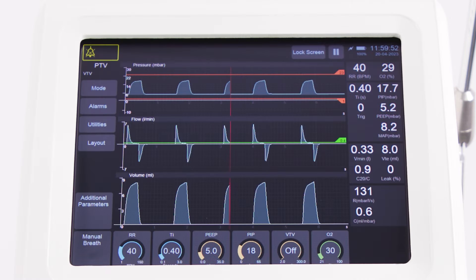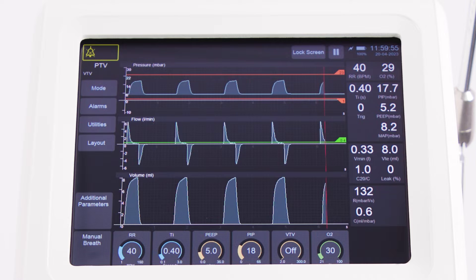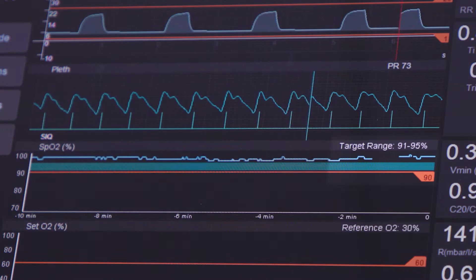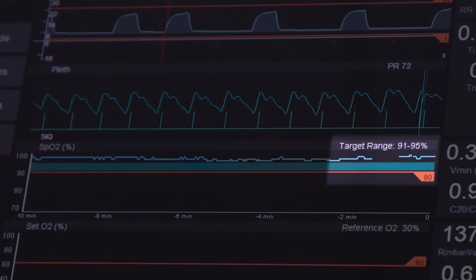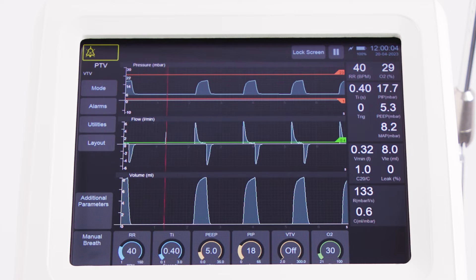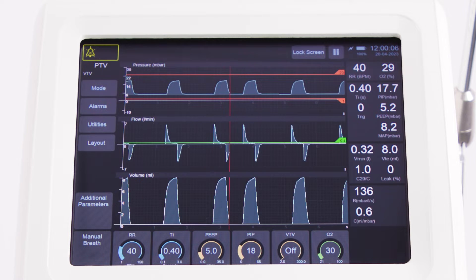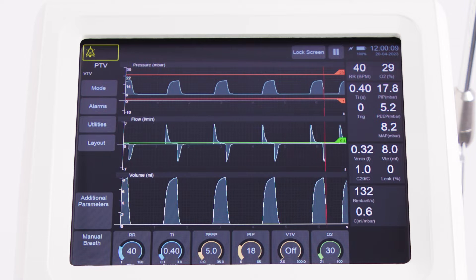The Oxygeni system controls the inspired oxygen concentration to keep the SpO2 of the patient within a predefined range. It can be used in any mode of ventilation, including HFO, conventional and non-invasive ventilation.